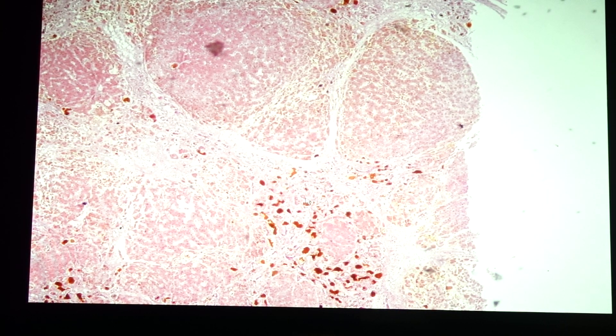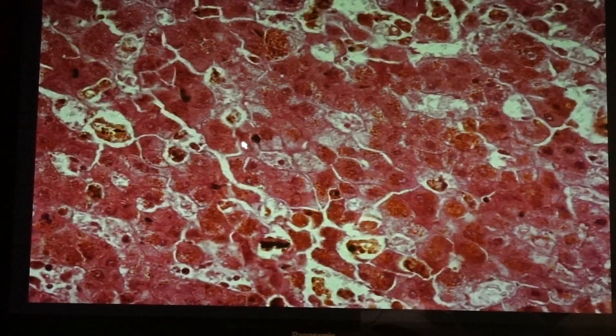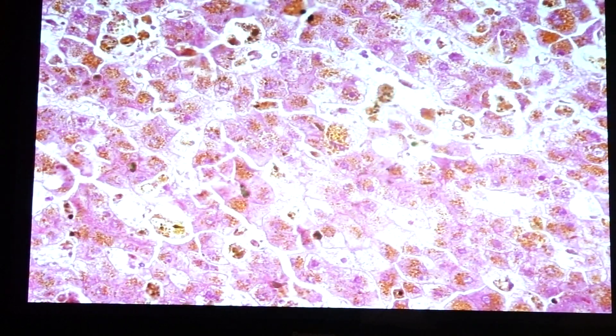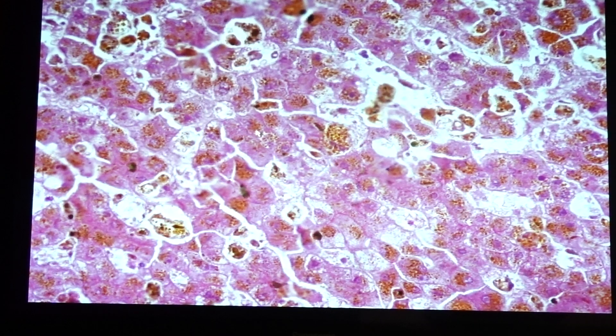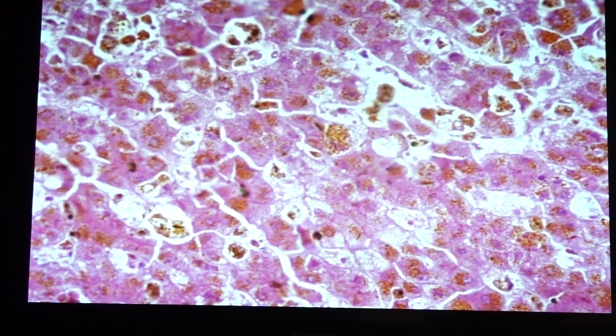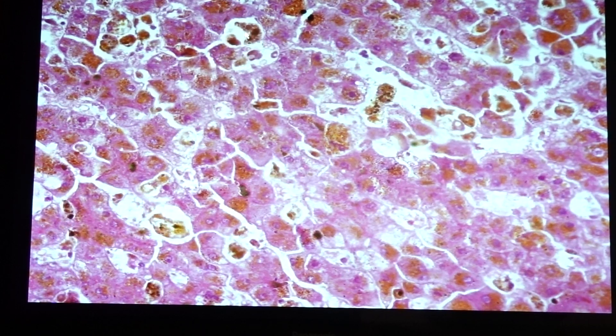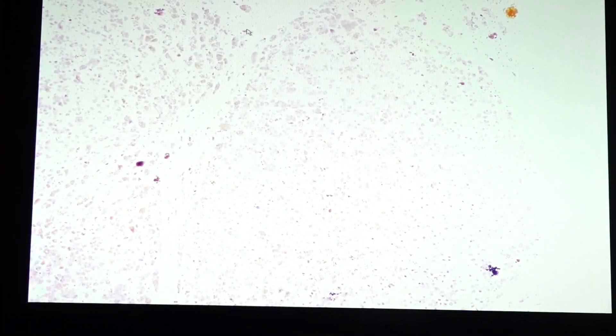These are what we call cholestasis — stasis of bile within the bile ductule. At higher magnification, we can see a nodular formation of regenerating hepatocytes, the presence of bilirubin pigments within the hepatocytes, and dilated bile canaliculi containing bile or bilirubin.